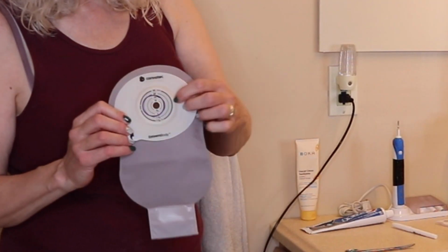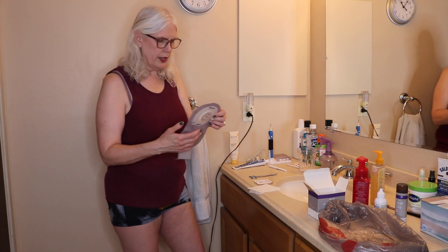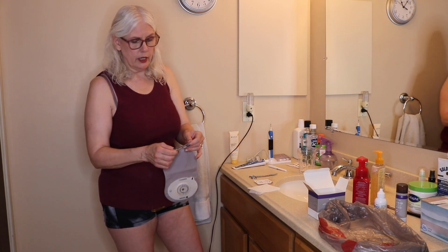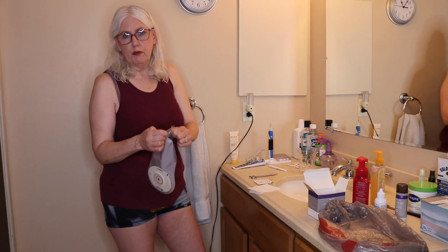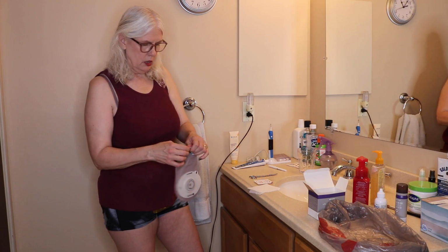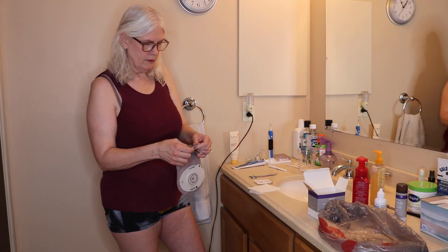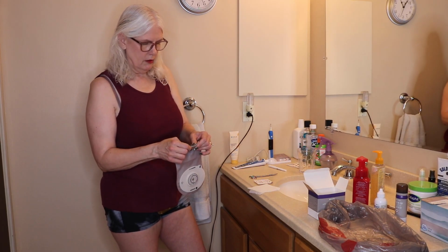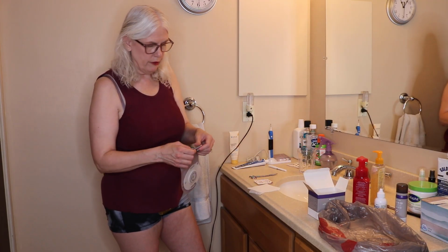So I usually kind of line mine up with the 1-inch mark, and then I see that it goes way over on this side. So I'll go ahead and cut that before I do that too, and make sure that I close the end up. It's something you don't want to forget. Much better if you have this all closed up before you start, because just in case as you're changing your stoma decides that it's time to go, you'll have the end closed and it won't have the ability to fall out and be all over the floor.